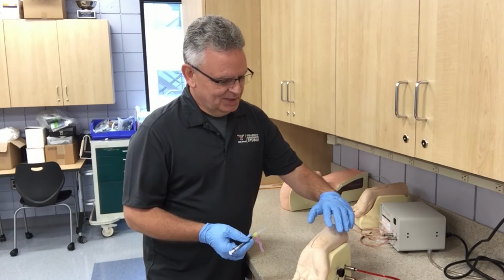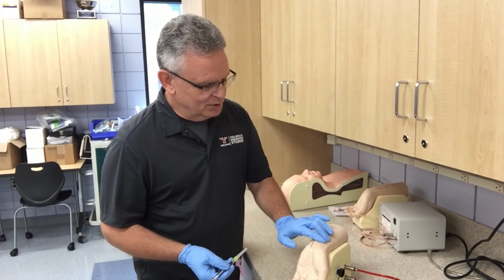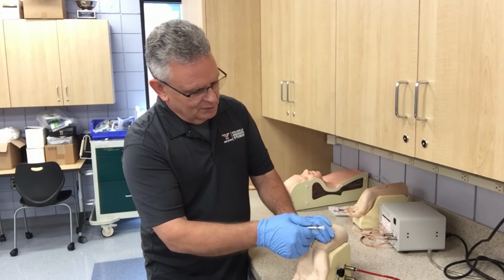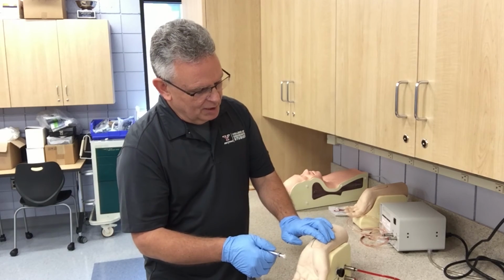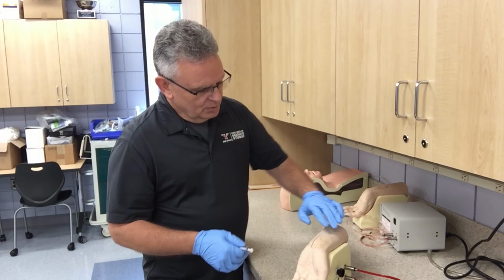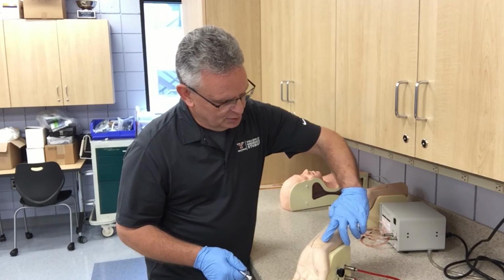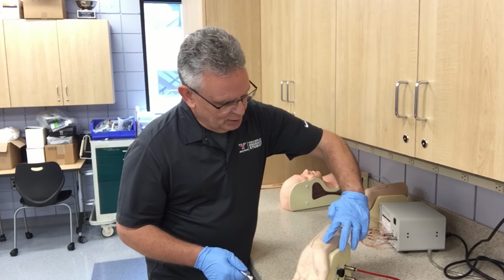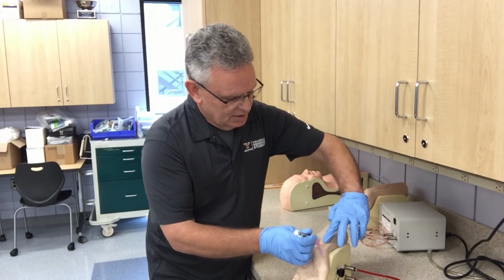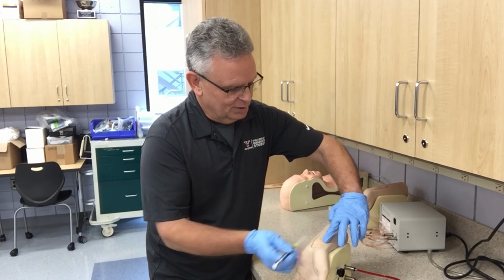So again, traditional techniques would have the fingers perpendicular to the artery, and in this case, the whole feeling of where that pulse is, at least in my opinion, is spread out over a much broader part of the finger, whereas with the Sal technique, when you're aligned linearly with the artery, you can palpate right on the tip of your finger there, line it up with the center of your fingernail, and it makes it much easier to go ahead and hit that artery on the first attempt.